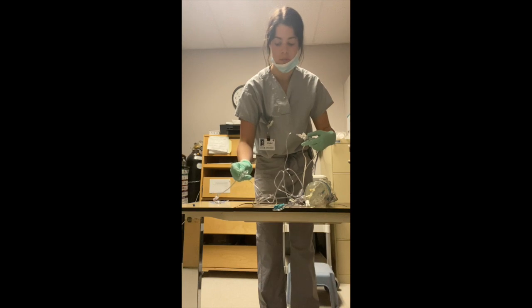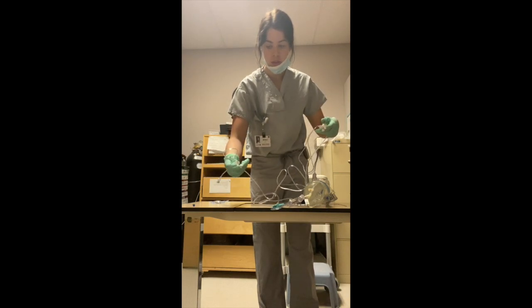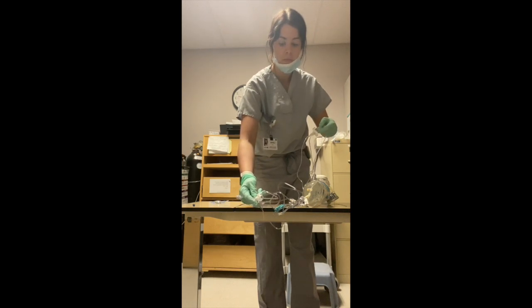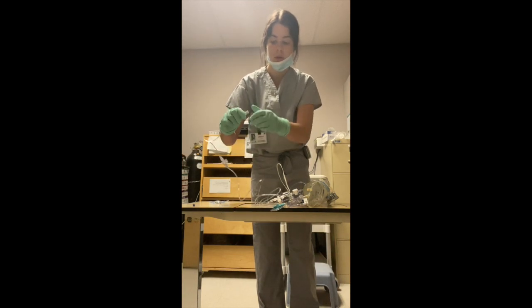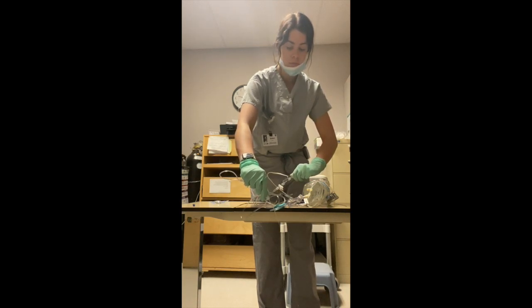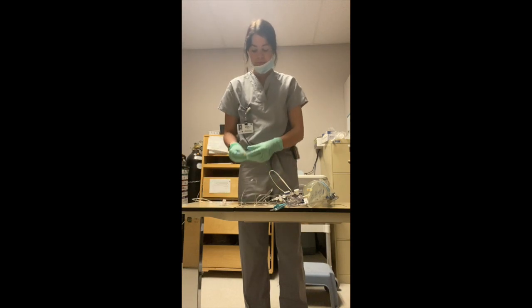And do the same thing with this one. We're going to turn it off this way, and continue to flush it so that there's no air bubbles. Then once again, we will switch it off to there, and finally flush it to the part that's going to connect to the patient. At the end of this, there should be no air bubbles.